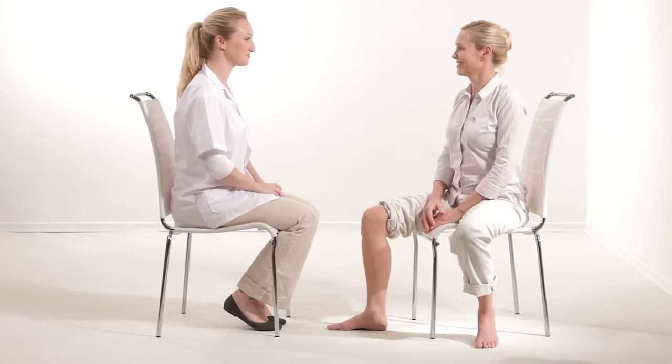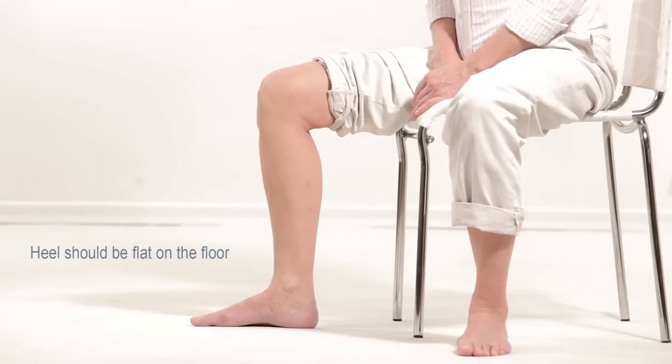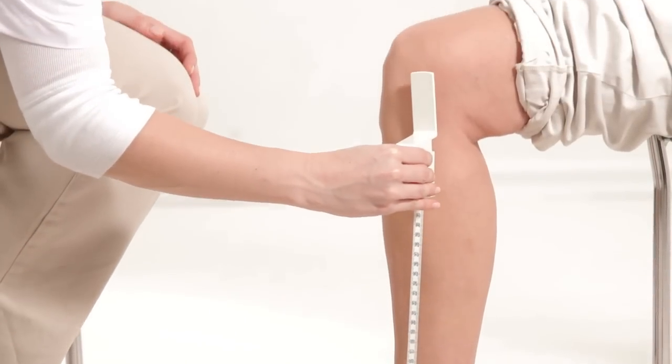To determine the tibia measurement point, the subject should be seated with the non-dominant leg bent at a 90 degree angle. The heel should be flat on the floor. Using the gauge, measure the distance between the plantar surface of the heel and the tip of the knee.